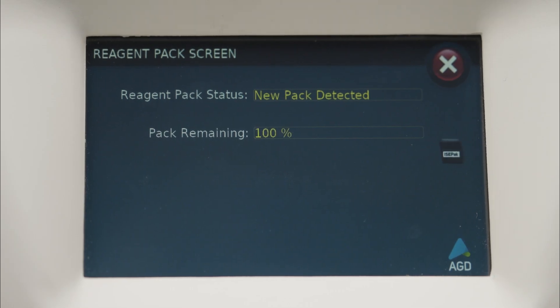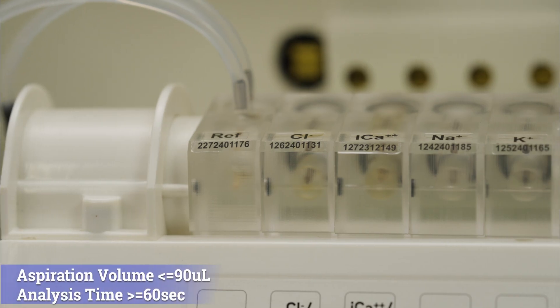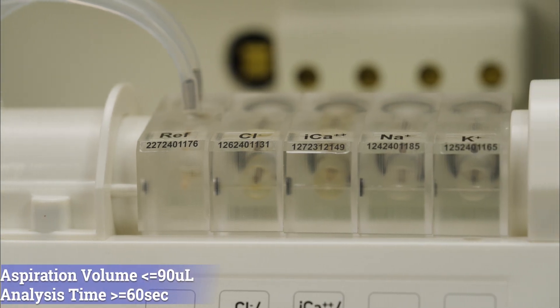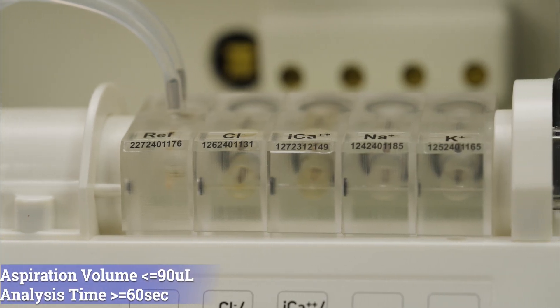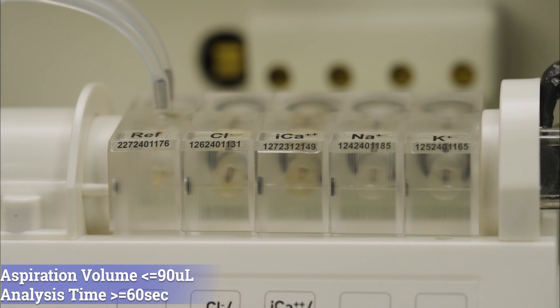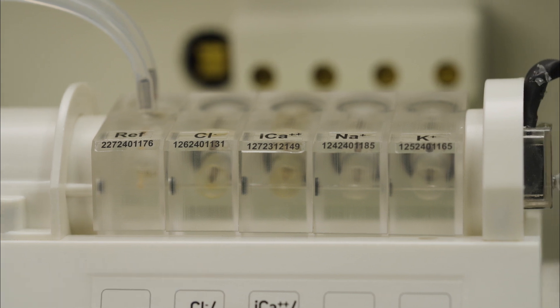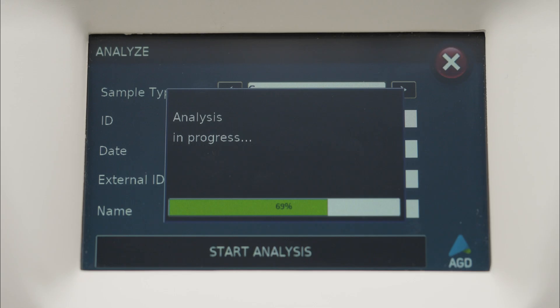Our electrolyte analyzer is capable of analyzing a wide range of sample types, including whole blood, plasma, serum, urine, and cerebrospinal fluid.